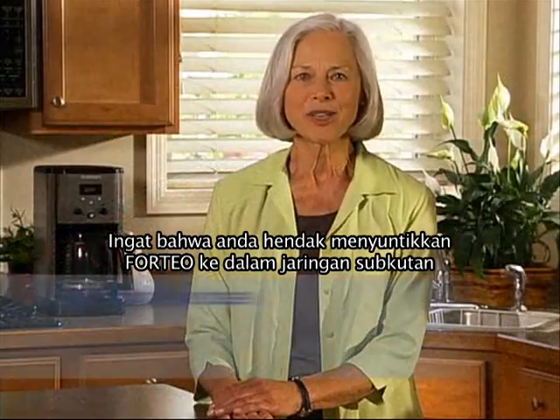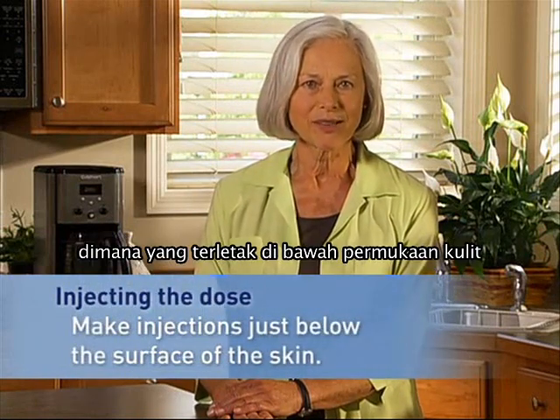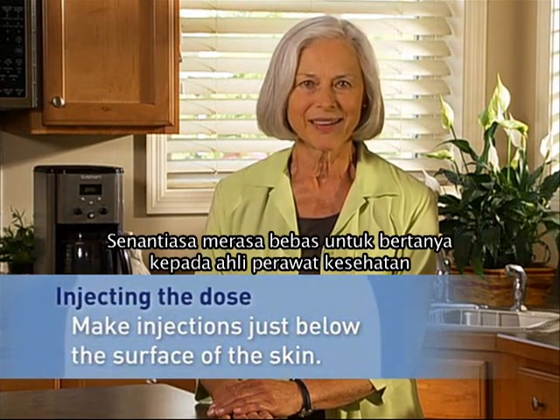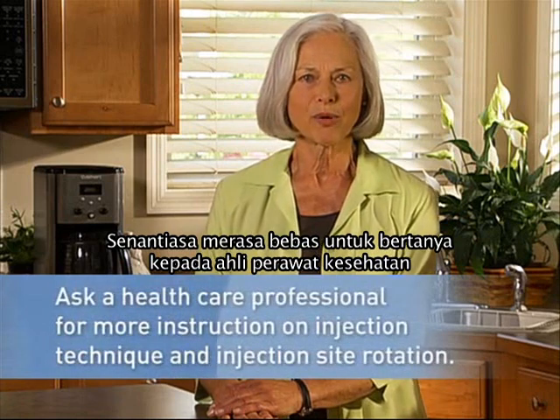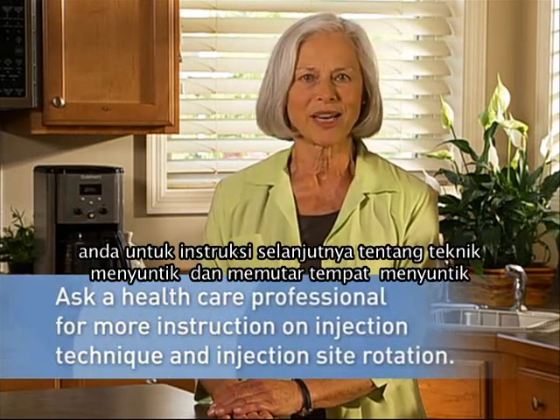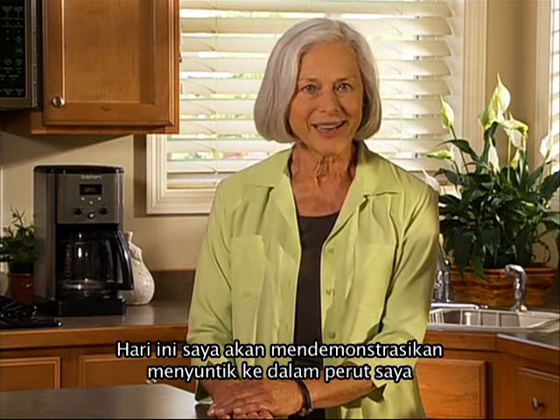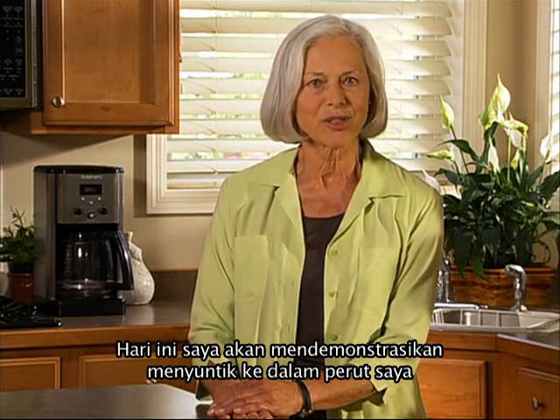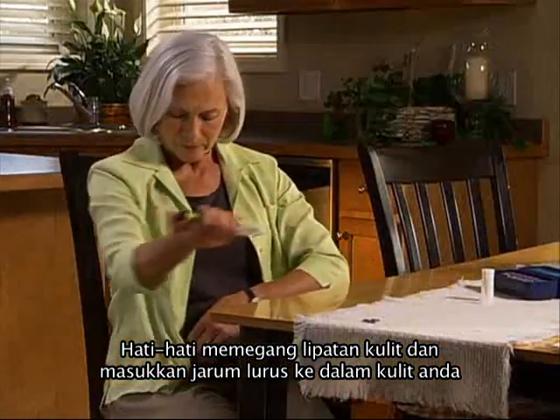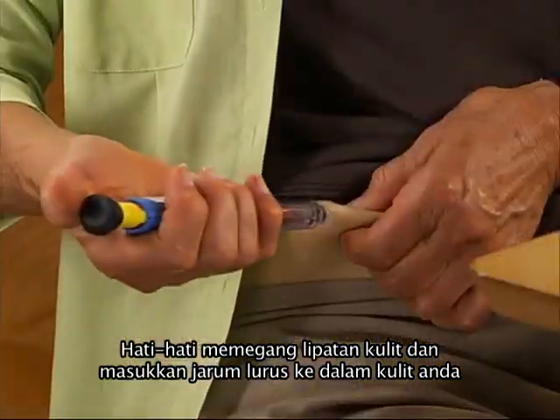Remember that you want to inject Forteo into the subcutaneous tissue, which is located just below the surface of the skin. Feel free to ask your healthcare professional for more instructions about injection technique and rotating the injection site. You can inject into your thigh or abdomen. Today, I will demonstrate an injection into my abdomen. Gently hold a fold of skin and insert the needle straight into your skin.